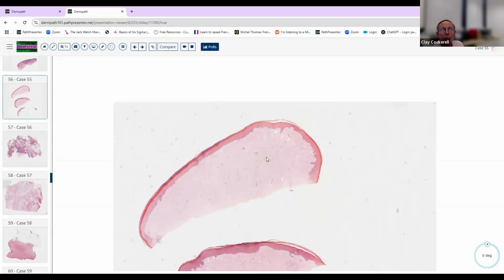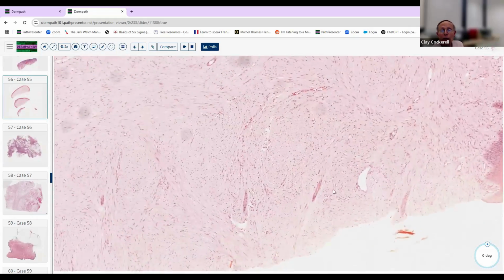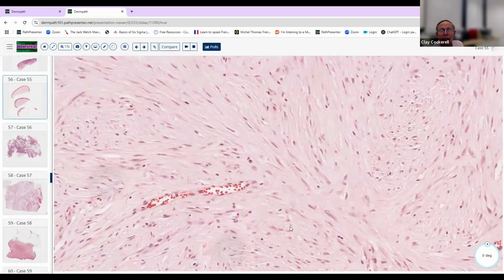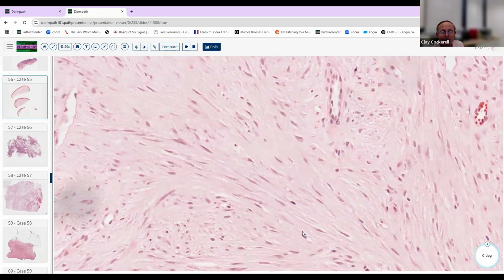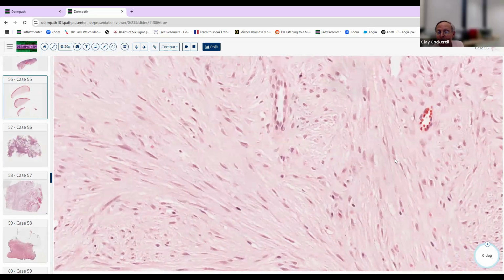Okay, here we've got a biopsy taken from acral skin. It's pale at low magnification, but you can see as we get to higher magnification, it's got these fascicles of cells. It looks almost like muscle a little bit here. But if you look carefully, it's got these apical red dots surrounding them. This is a subtle finding, but it's present.